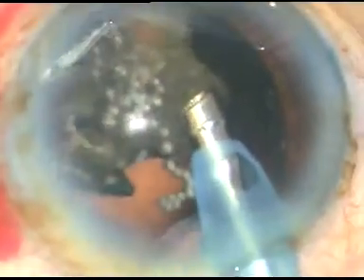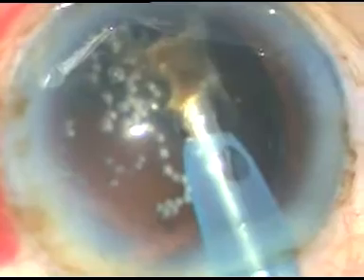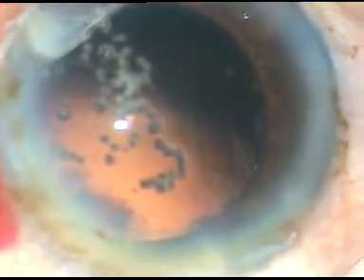This is the last portion of the nucleus. I have removed the chopper to make the anterior chamber more stable — surge is not a concern, but still, to make the anterior chamber more stable, I have removed the chopper. The hard nucleus has been conquered.